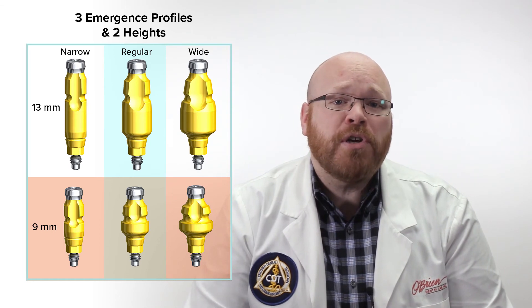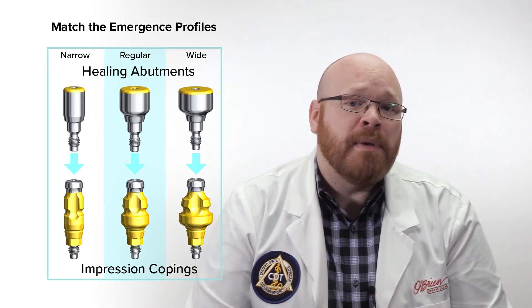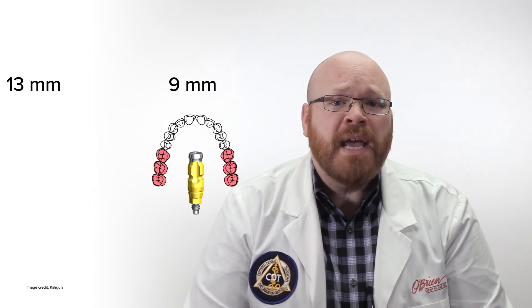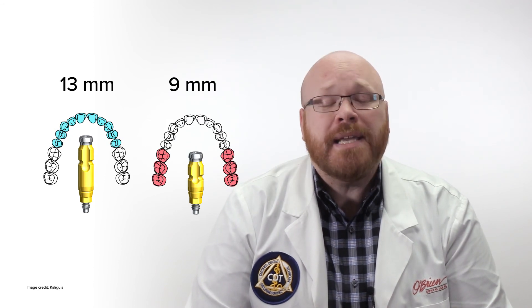When you're picking the impression coping, you should take into consideration the emergence profile of the healing abutment that was placed, so you can choose a diameter that matches. Additionally, the 9mm short impression copings should typically only be used for molars, and the 13mm coping should be used for anteriors and premolars in most situations.